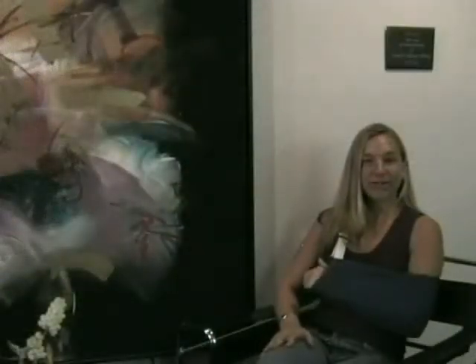Since I broke my arm, putting on my pants has been quite difficult, but with the Cinchstrap it's made it a lot easier.